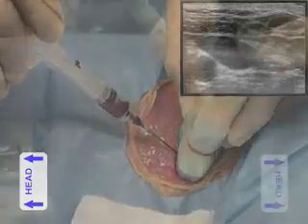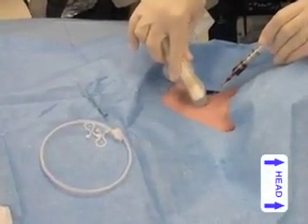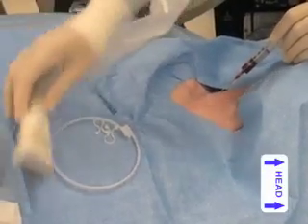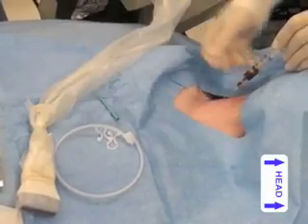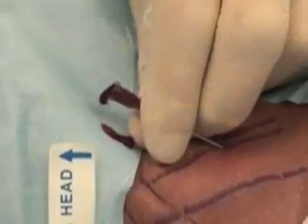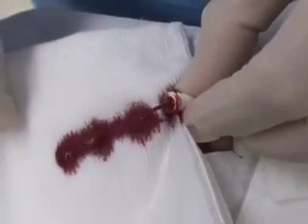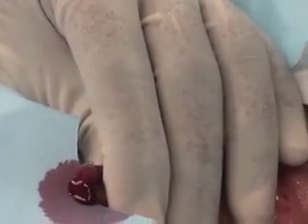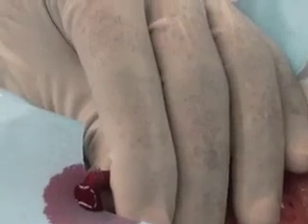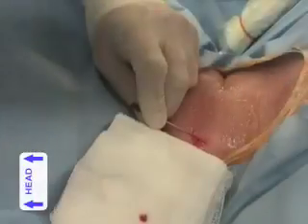As soon as blood is freely aspirated, place the probe in the predetermined sterile location, stabilize the needle, and disconnect the syringe. Confirm that the blood flow is non-pulsatile. Bright red pulsatile blood is suggestive of arterial puncture. However, dark, non-pulsatile blood does not exclude the possibility of arterial puncture.